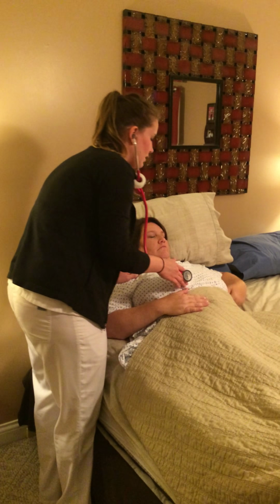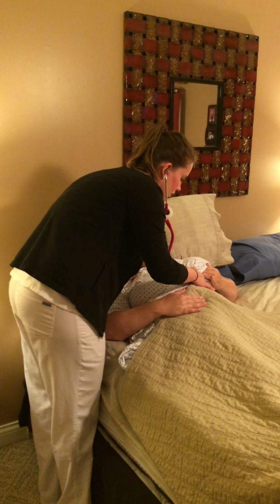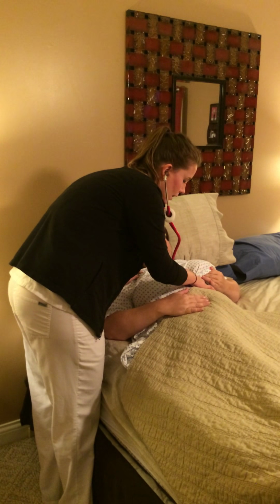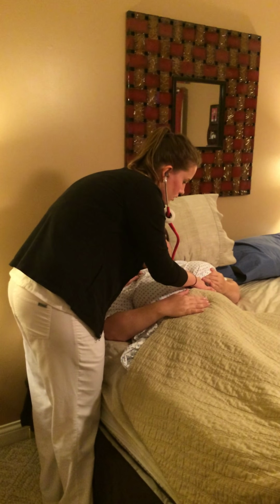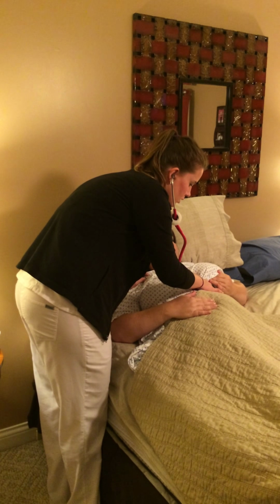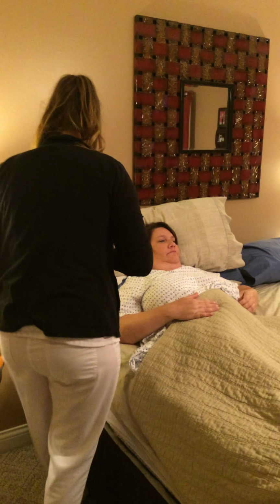And I'll ask the patient again to displace the breast for me, and I'm going to listen to the apex of the heart in the fifth intercostal space, midclavicular line. Thank you.